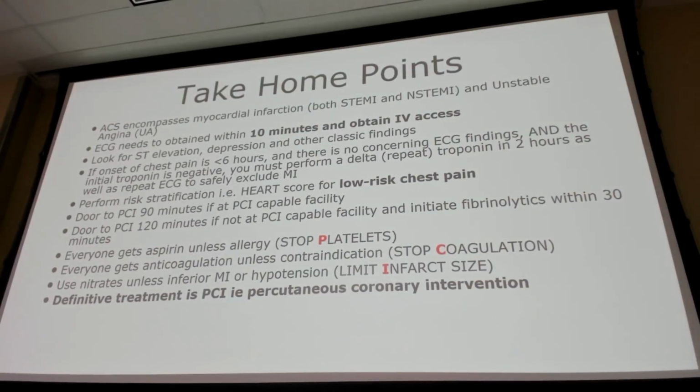I don't know why the take-home points are at the front. I probably should change it, but this is just a brief overview of what we're going to talk about today. We'll start with some practice EKGs and cases here. But really, we want to decide whether it's an acute coronary syndrome or acute myocardial infarction.